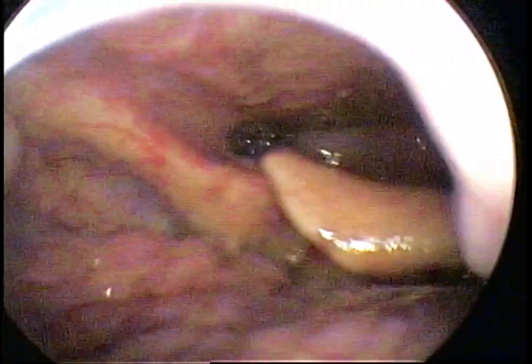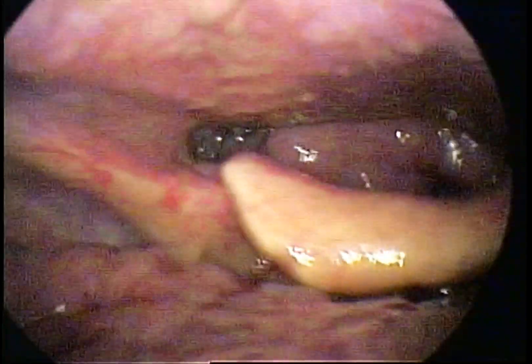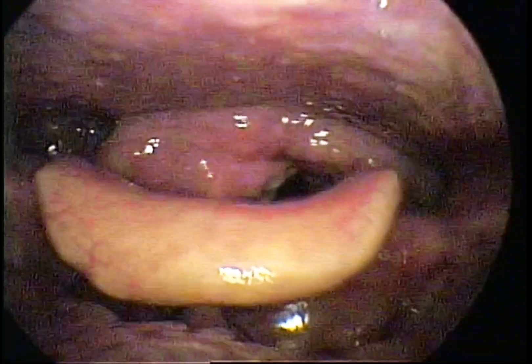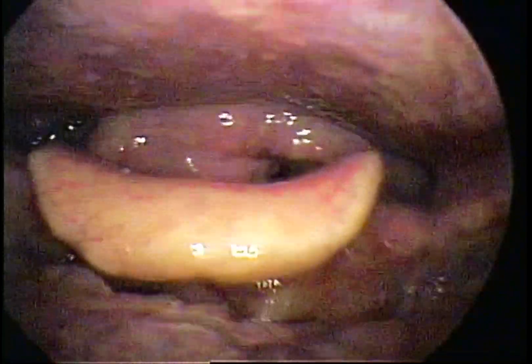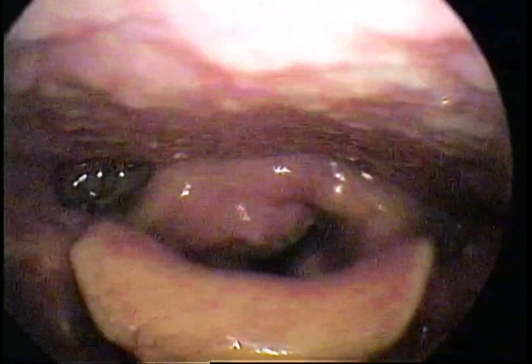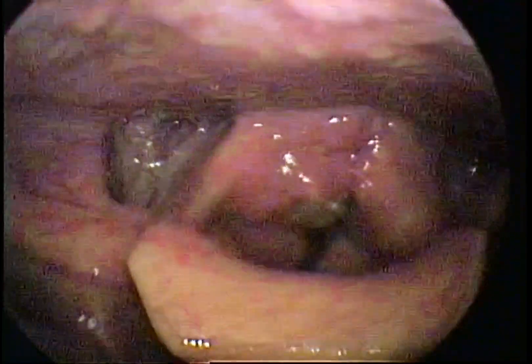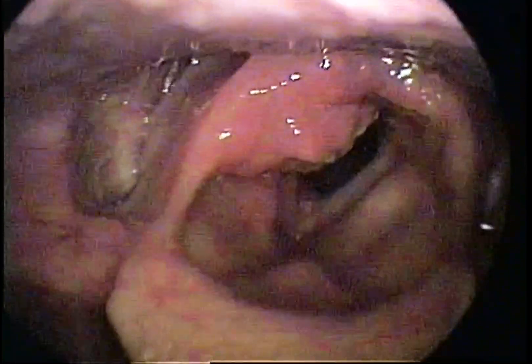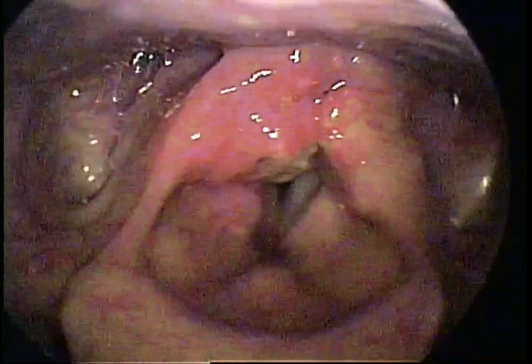This is the endoscopic camera view of the patient's throat. This patient is addicted to chewing tobacco. The camera is displaying an inside view of the throat below the last part of the tongue.